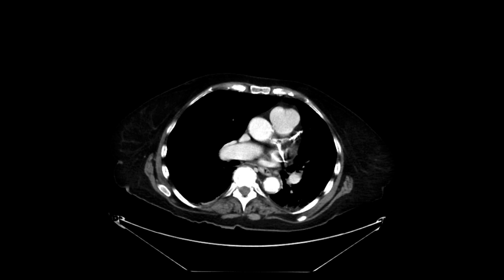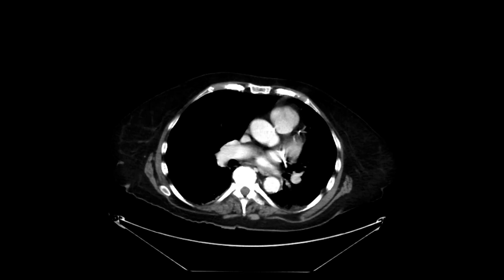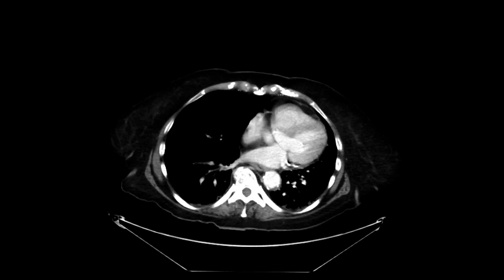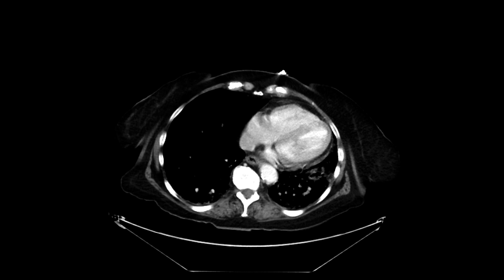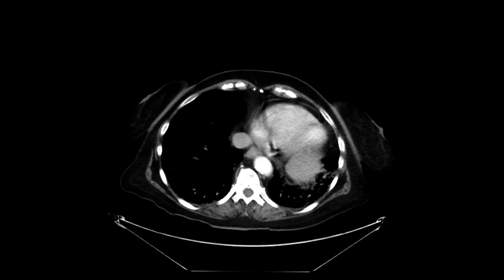This is a patient who came in with abdominal pain, nausea, and vomiting. For that, we got a CT scan with intravenous contrast of the abdomen and pelvis.